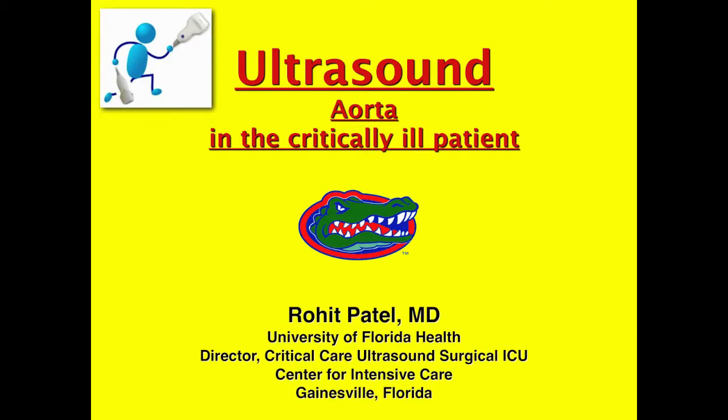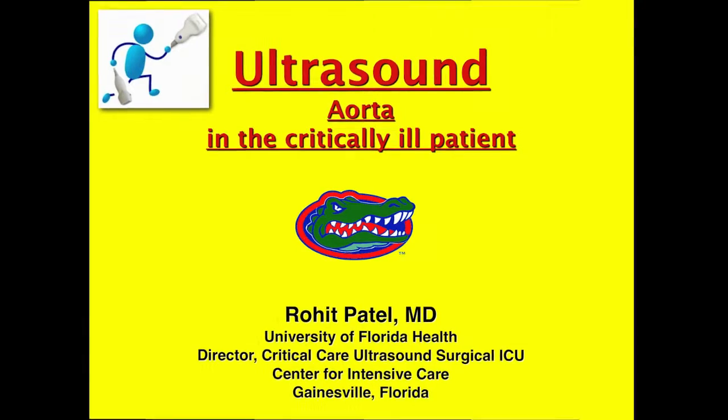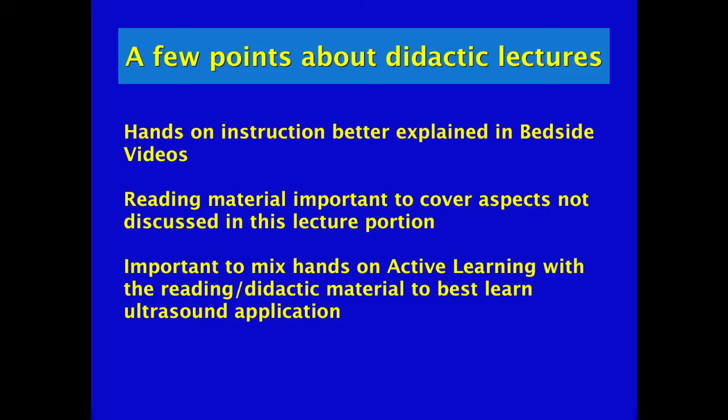Ultrasound of the aorta in the critically ill patient. A few points before we move forward about didactic lectures. Remember, hands-on instruction is better explained in the bedside videos portion of the curriculum. Reading material is also important to cover aspects that are not discussed in this lecture portion.